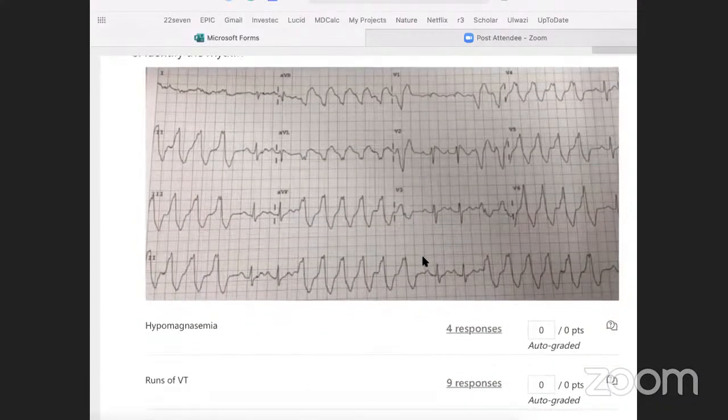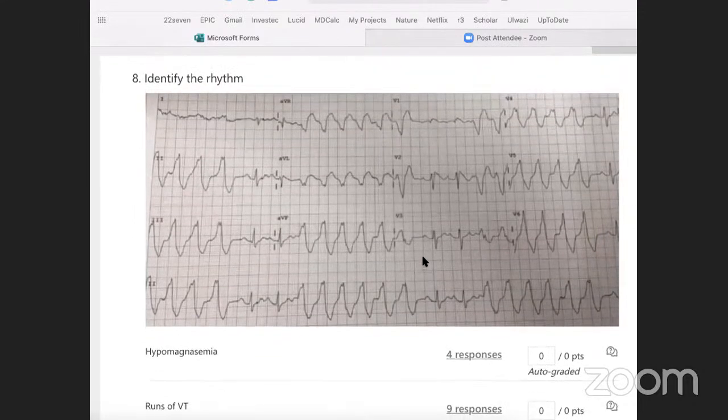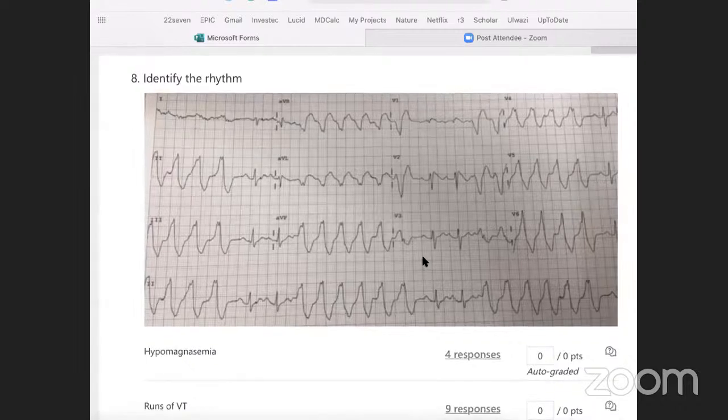Alrighty, some tough ECGs around here. So here we have really broad, bizarre beats and difficult to interpret. And for myself, if I'm sitting in the casualty and someone brings an ECG like this to me, I would look at the top of my ECG machine and the interpretation that says ST T wave non-specific changes, MI likely, and then I would sign and say I'm not sure and refer off to hospital.